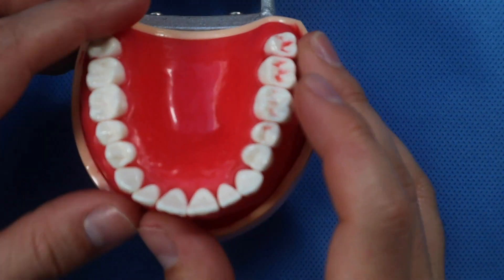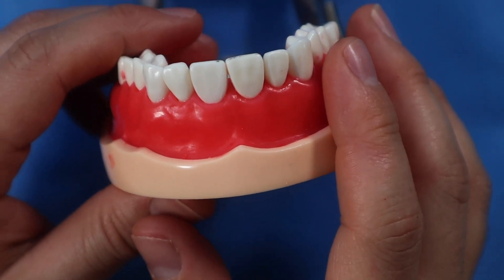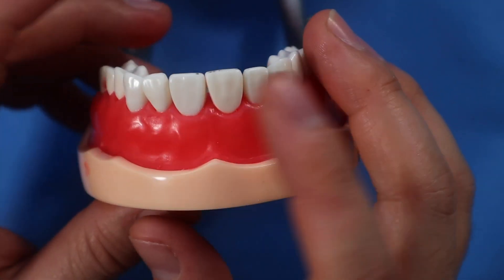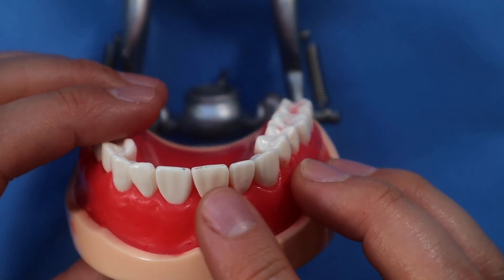It was a pretty popular request to see how to do immediate loading on a single implant — immediate temporization. I'm going to show you here on this typodont. We'll go ahead and do number eight.